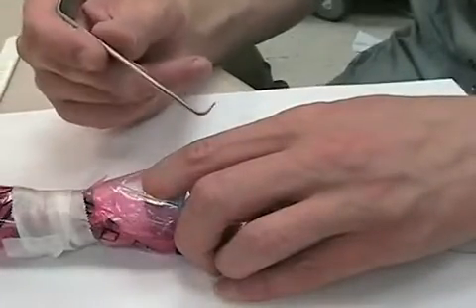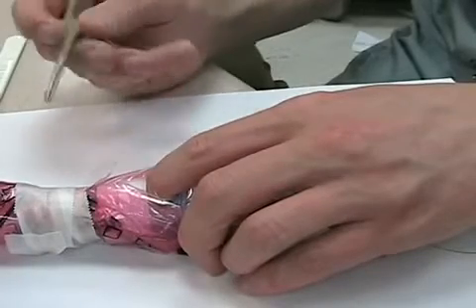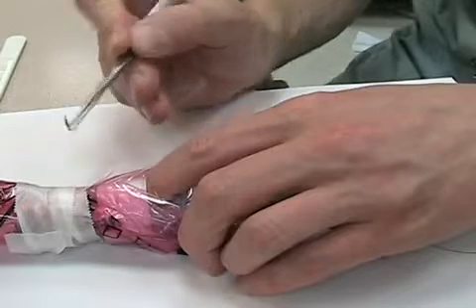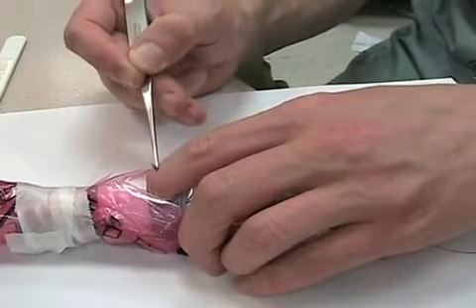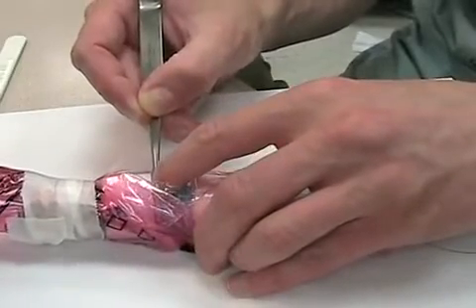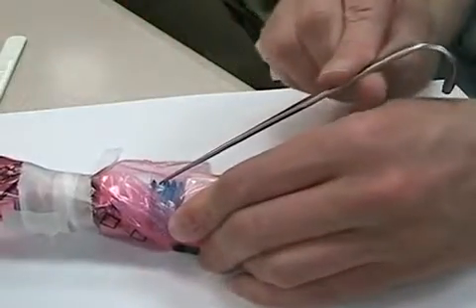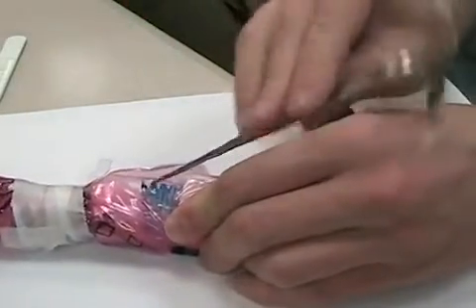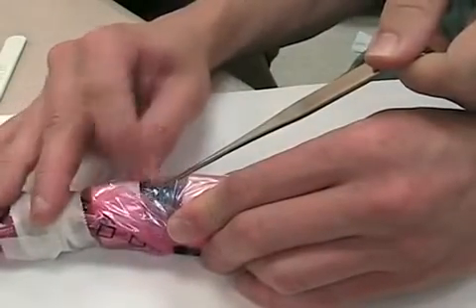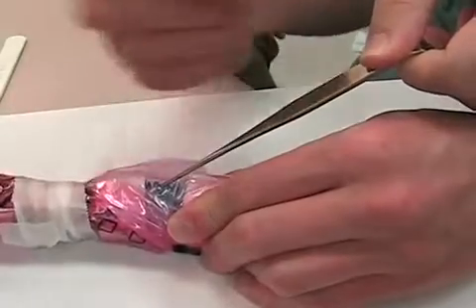Grab your tracheal hook. It goes in with the spike end facing the ceiling — not spike end down or you'll cut your finger. Spike end facing the ceiling puts the nice soft rounded tip up against your index finger, and you slide that into the hole. Now you can take your index finger out because the hook is in there. Hand this off to a partner and retract towards the head. They hold the hook inside the trachea, holding up the membrane, facing towards the patient's head.